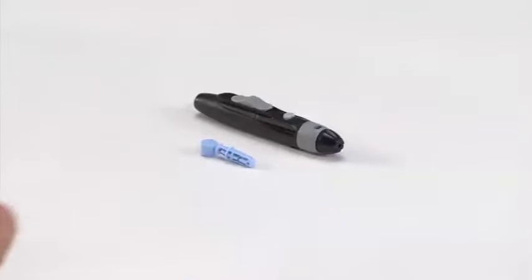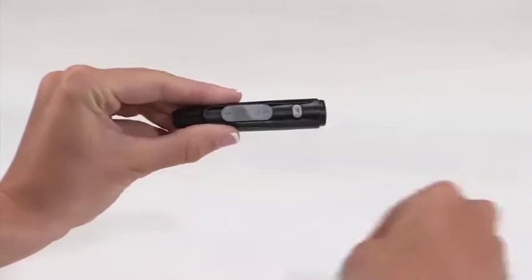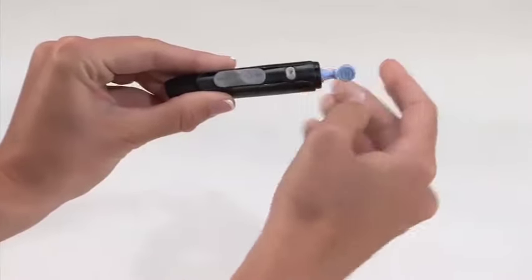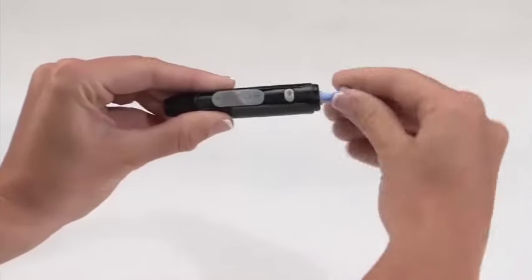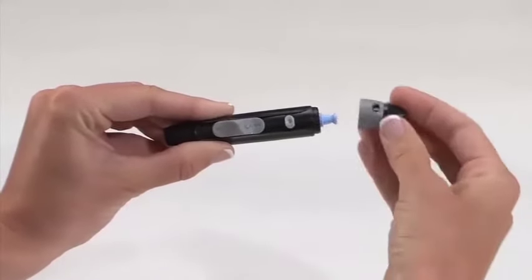First, remove the lancing device cap by snapping it off at an angle. Insert a new lancet firmly into the blue lancet holder. Twist off the lancet cover. Replace the cap until it snaps or clicks into place.